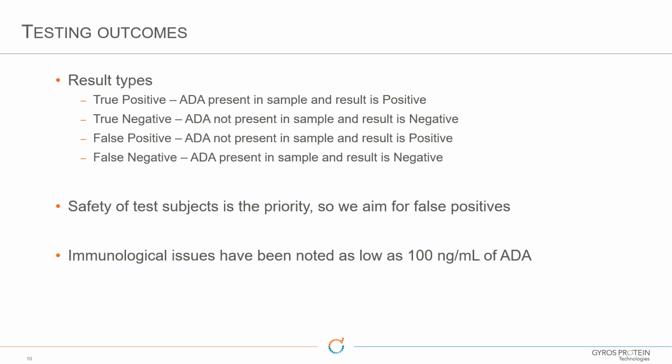This is obviously something we want to avoid, but if the drug levels are extremely high, there is always a possibility that we can't measure the ADA because of the presence of drug, which will interfere. And that's why drug tolerance is so critical, to really understand where you're at from a drug tolerance perspective. Exactly, but the trouble is that drug tolerance, like sensitivity, is completely dependent on what positive control you use. So it makes it complicated.